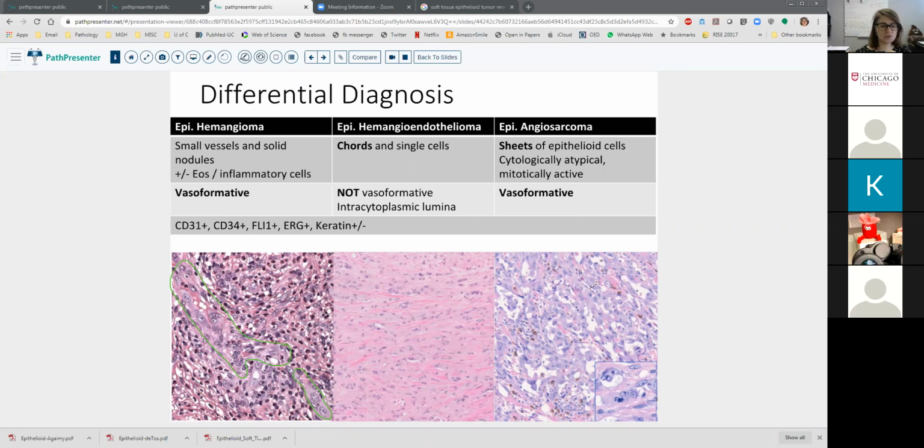In the angiosarcomas, they will not have a pericyte layer around them, neither really in the hemangioendotheliomas. So we have used the presence of a myoid pericytic layer around those to help put them in the appropriate category when it's confusing. Does that make sense?